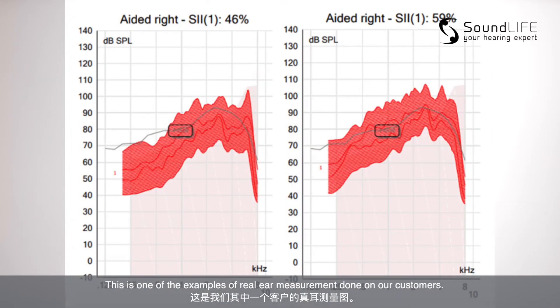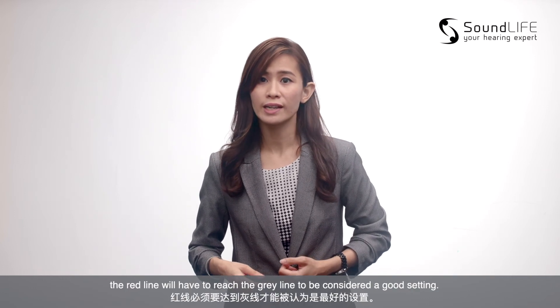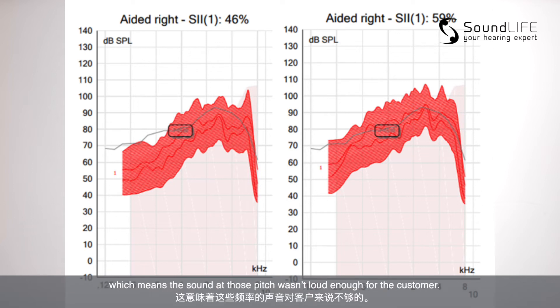This is one of the examples of real ear measurement done on our customers. The graph on the left shows the measurement before adjustment, and the one on the right shows the measurement after the adjustment. The grey line represents the prescriptive target, whereas the red line represents the hearing amplification that was being measured by the probe microphone in the ear canal. For this real ear measurement process, the red line will have to reach the grey line to be considered a good setting. As you can see, the low frequency and high frequency were under-amplified before the adjustment, which means the sound at those pitches wasn't loud enough for the customer.